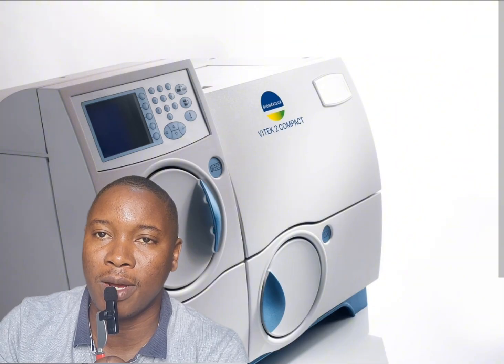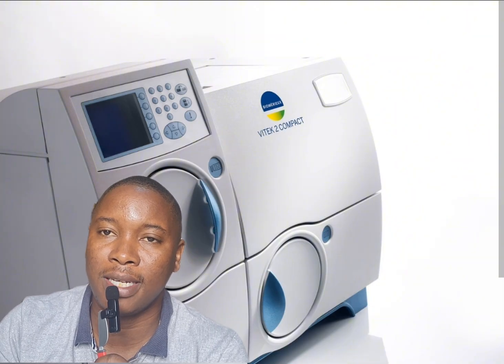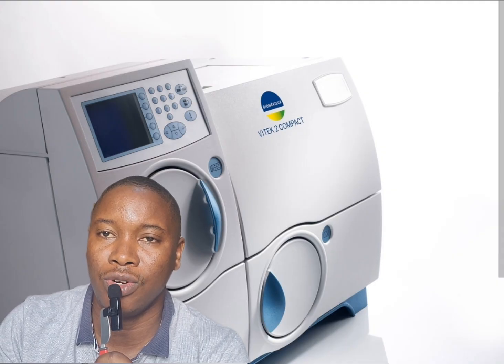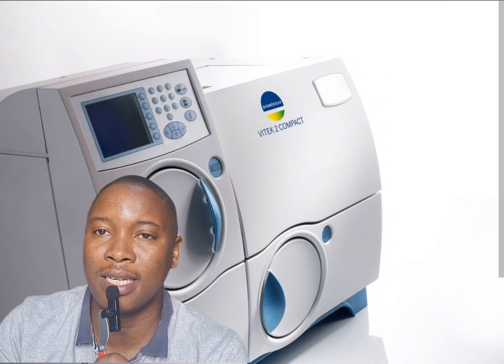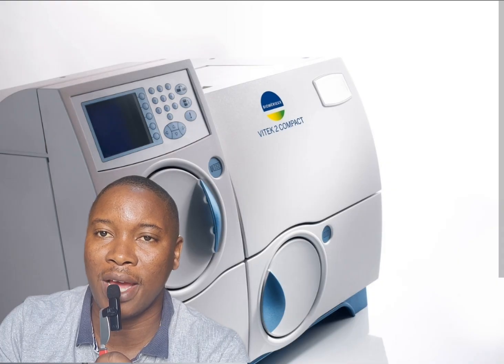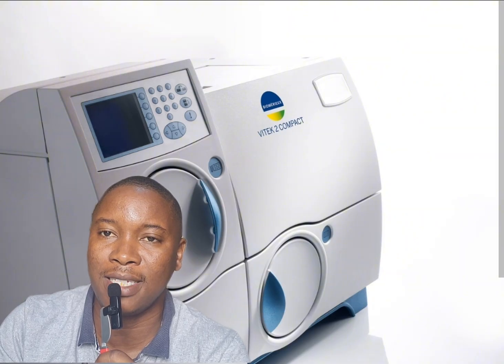Now, when we have this microbial growth, the problem we now have is how to identify these microorganisms. Many a times we have to go through a series of biochemical reactions. We've been discussing these reactions: indole test, catalase test, citrate test, methyl red test. These are all different tests that we could employ in our quest to try to identify microorganisms. But then there is also an automated system which uses a Vitek machine.